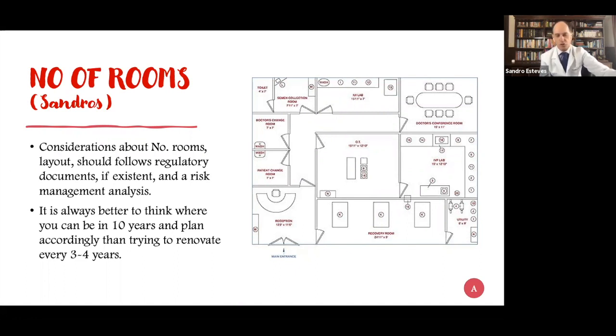Obviously, we try to distribute the patient flow. And we have separate rooms for embryo transfers, with an air pressure differential between the IVF lab, the operating theater, and the embryo transfer rooms, in which the embryo transfer rooms are not as clean as the operating theater and the IVF lab.